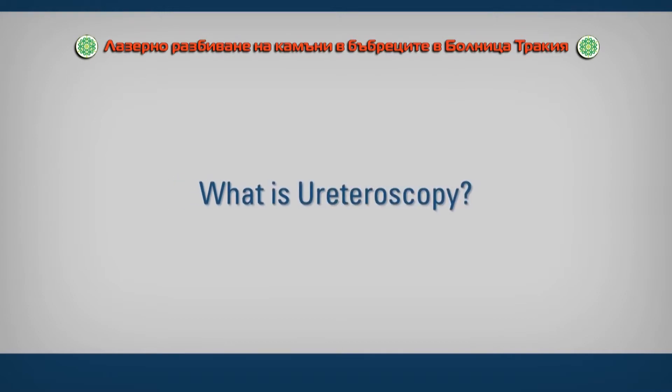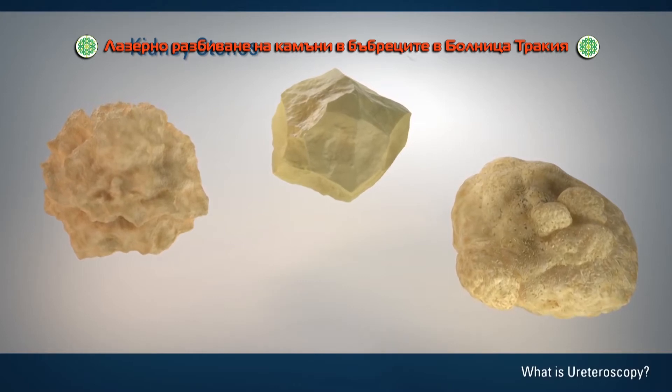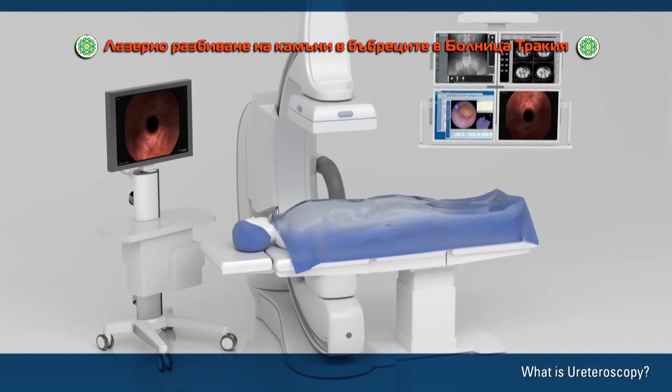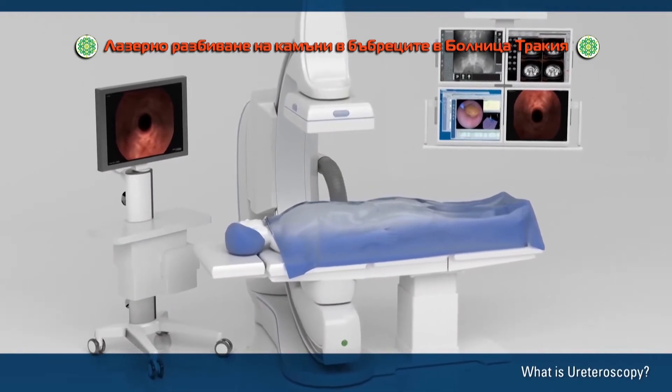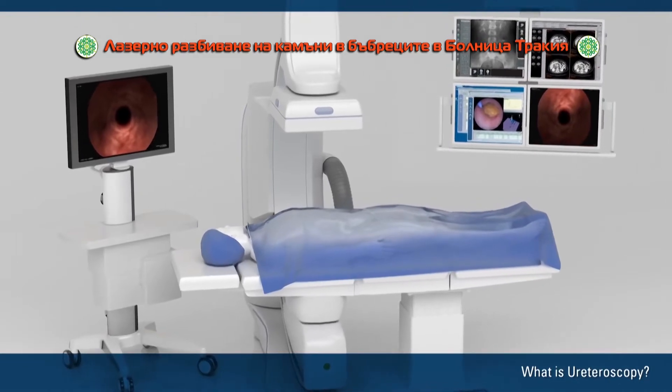Ureteroscopy is a type of surgery to treat kidney stones. A surgeon does the procedure in a hospital operating room or an outpatient surgery center. Ureteroscopy usually takes 30 minutes to 2 hours.